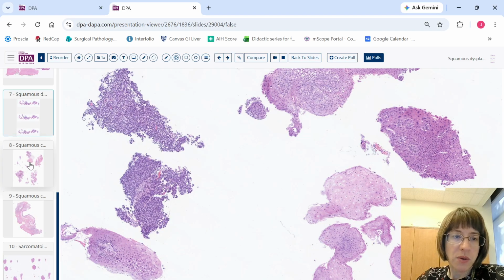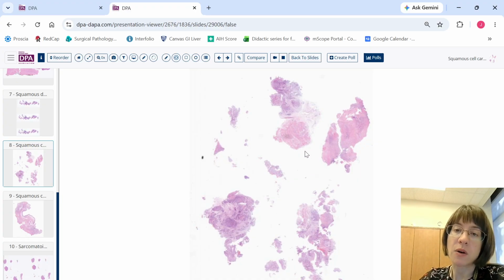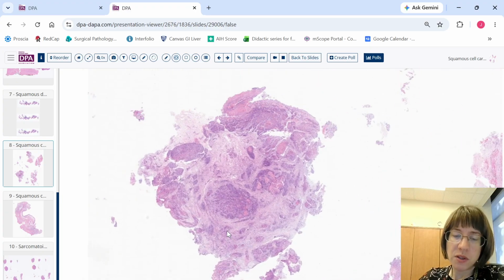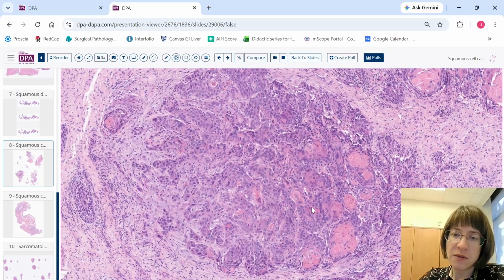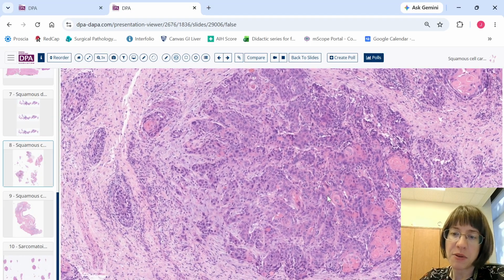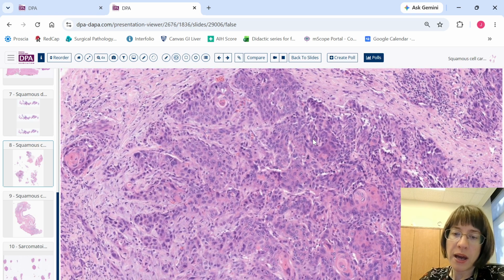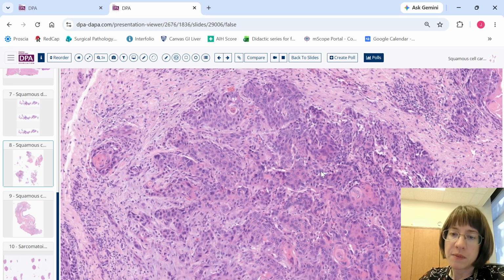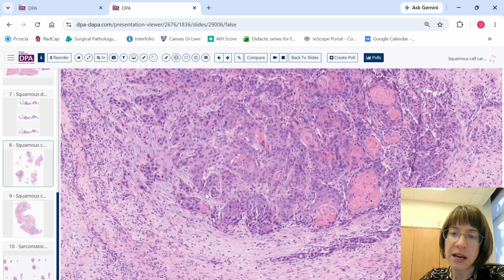So going to our next case, this is an example of a biopsy that I can call on biopsy invasive squamous cell carcinoma. So I want to zoom in on this piece, and we see that we have these very irregularly shaped nests of neoplastic epithelium that are embedded in fibrous stroma. So I can't really think of any way that this could all connect up and be just an in situ lesion. This to me looks invasive given these very irregularly shaped nests.